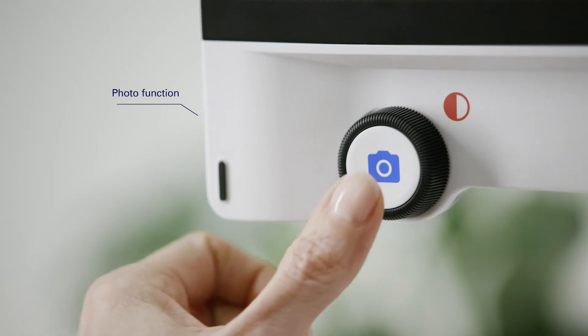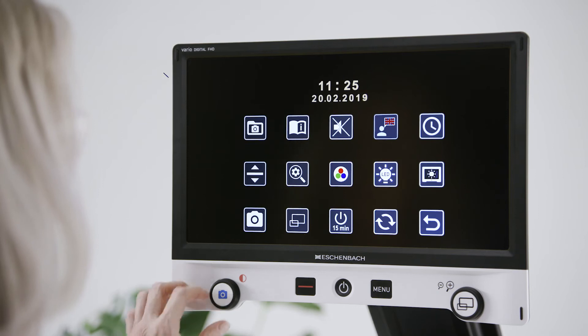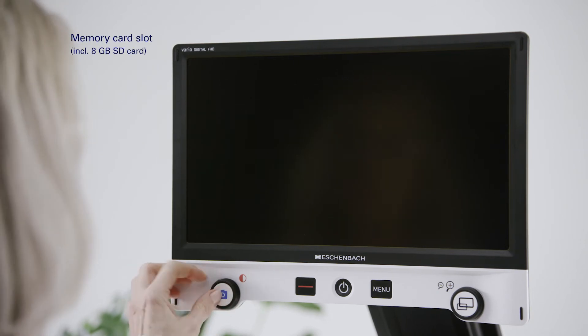The photo button is used to create photos from the selected image section, and these photos can be saved on an SD card and retrieved via the menu.